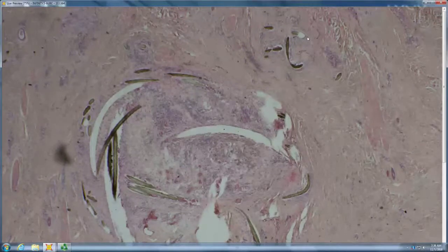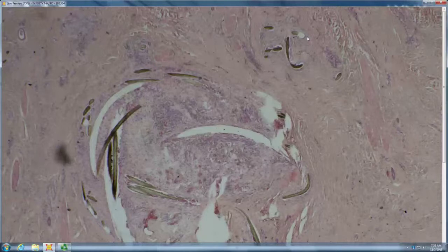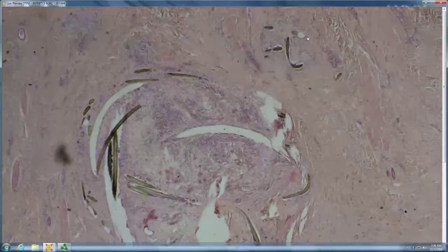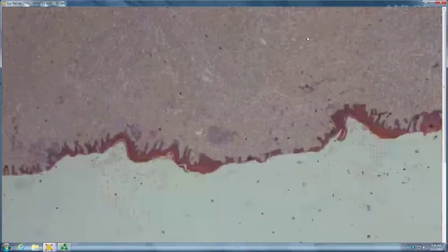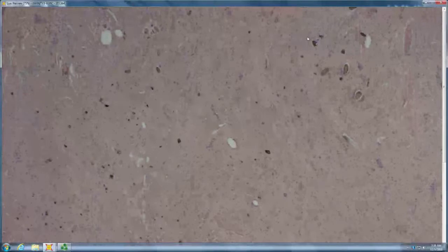No, they're both horizontal and perpendicular. Yeah, ingrown and twisted, curled, right? So you've got curled free hair shafts with granulomatous reaction, lots of free hair shafts, right? Acne keloidalis nuchae. And then you've got lots of hypertrophic scar, right? So where's the keloid in acne keloidalis?